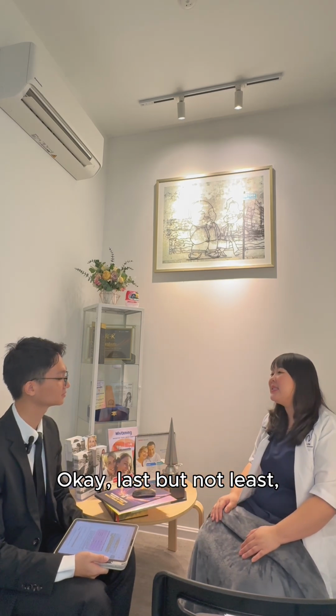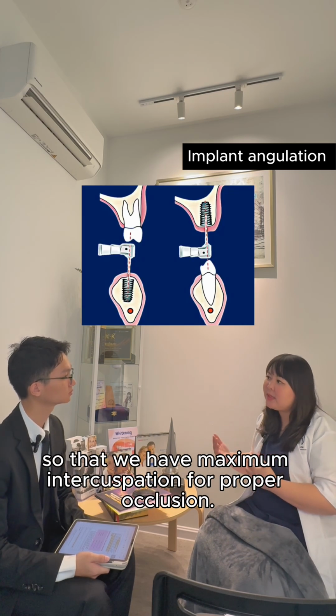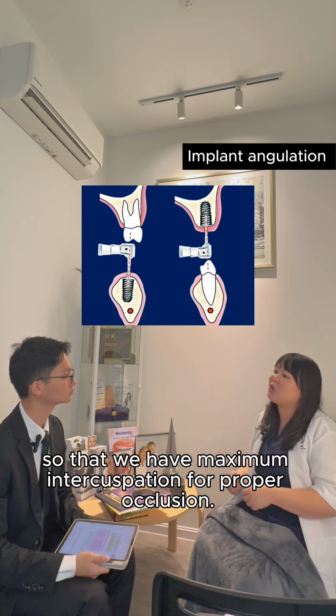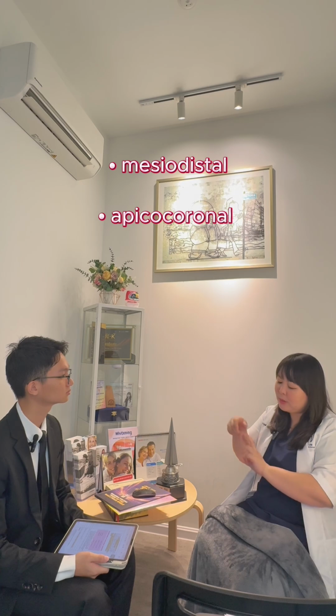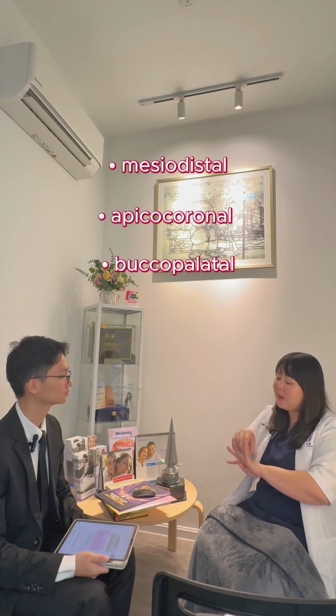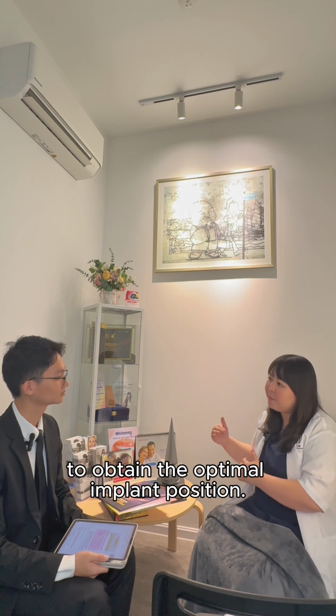Last but not least, look at the implant angulation so that we will have maximum intercuspation for proper occlusion. So these are the four things that we have to look into: mesial-distal, the crown height or apical-coronal, buccal-palatal, as well as the implant angulation. So it's a combination of everything to obtain the optimum implant position.